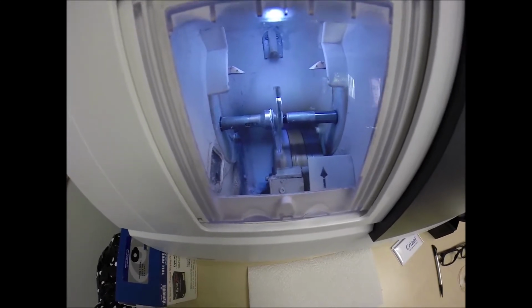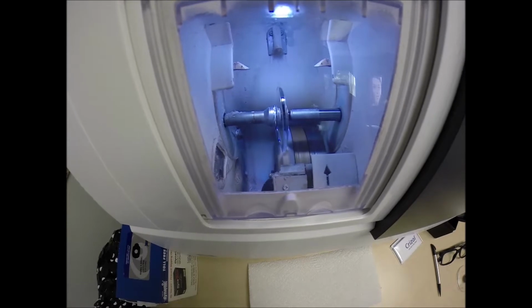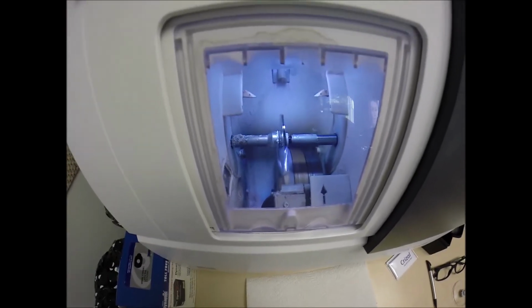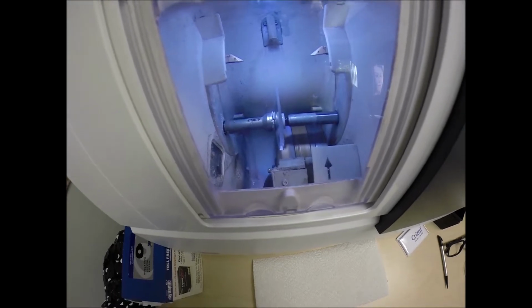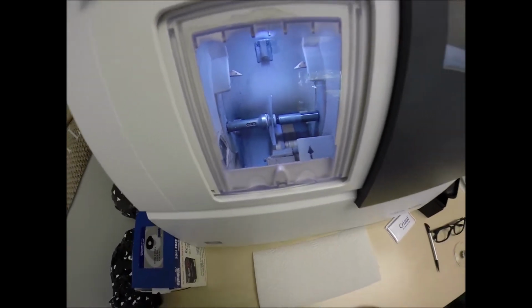But the lens is going to drop down onto the cutting wheel. You see water in the background. That's there to catch the optical sawdust. Polycarbonate lenses cut dry, where plastic, high-index plastic, and Trivex materials cut wet, meaning that water sprays onto the lens for the duration of the cutting cycle. Now, it will spray onto your lens, but only for the last 20 seconds to wash away the optical debris you see beginning to form on the edge of your lenses.